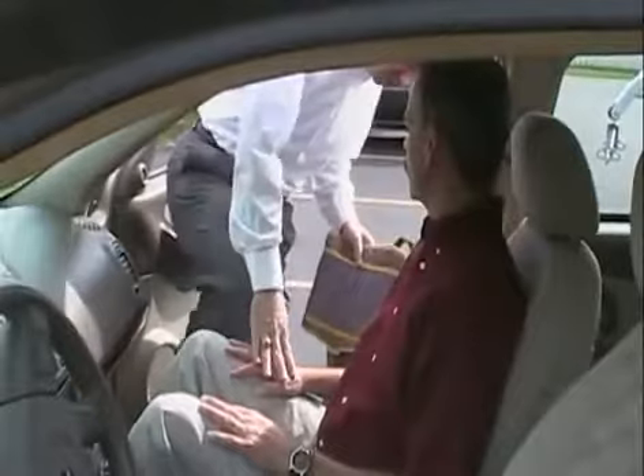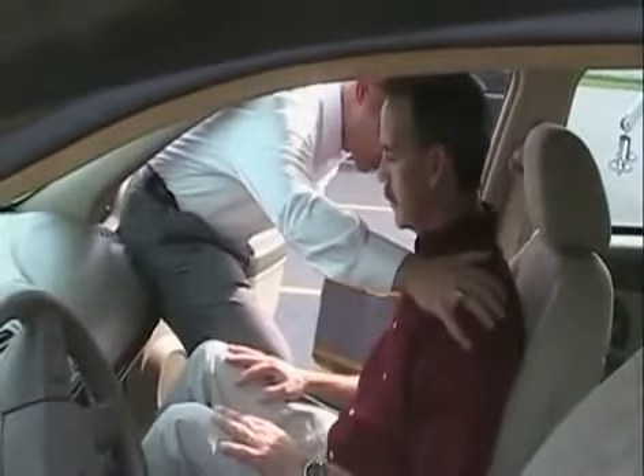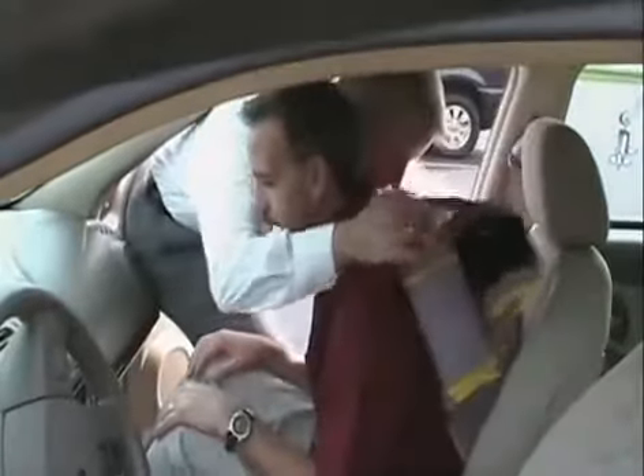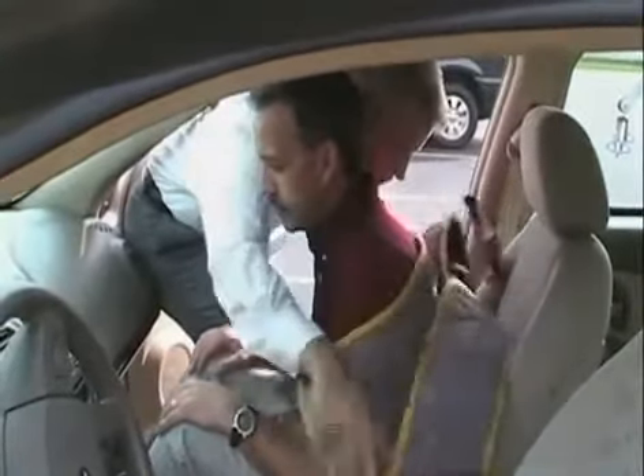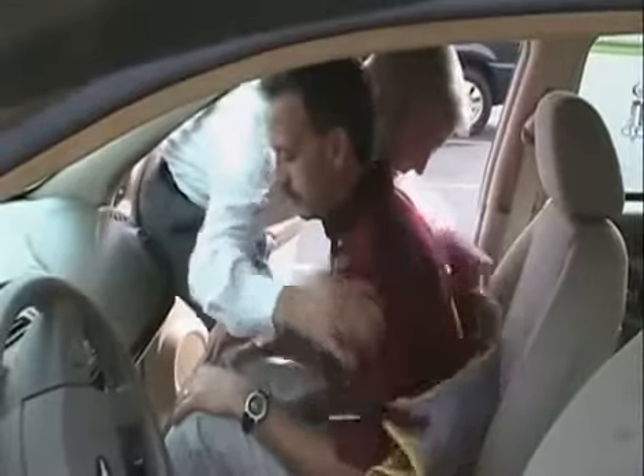The first thing I'm going to do is fit a sling, and I'm going to use that to transfer you. So if you can help me out, that's great. I'm going to lean you forward and I'm going to tuck the sling behind you — actually put the straps on each side. After I've done so, I'm going to go ahead and lean you back.